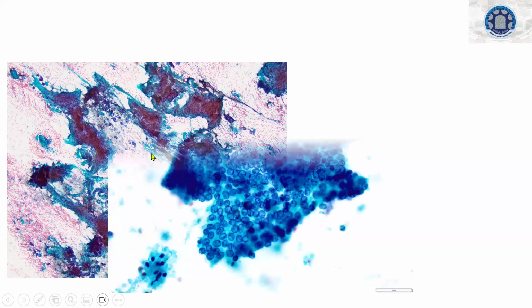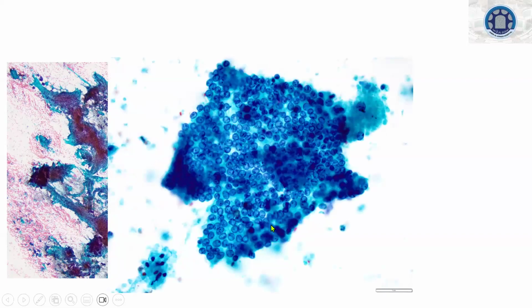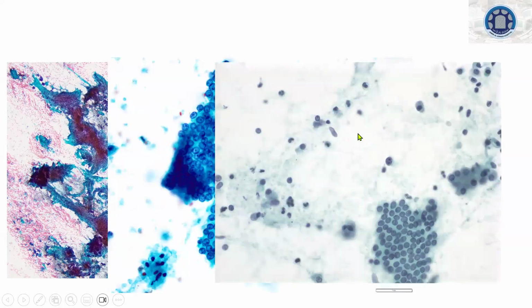Suppose this is the aspirate from a 40 to 50-year-old male. There's history of alcohol abuse. There is an ill-defined mass. They are suspecting malignancy. And you're seeing this fibrous tissue with few acini here and there, but basically atrophic and a lot of inflammatory cells. And you're seeing this ductal epithelium, which is just reactive, not showing many features of malignancy. The background is a little dirty, but a lot of inflammatory cells. You're seeing little reactive ductal epithelial cells and little reactive acini. What is your diagnosis?